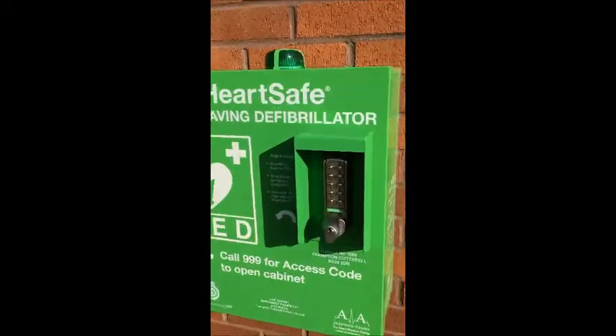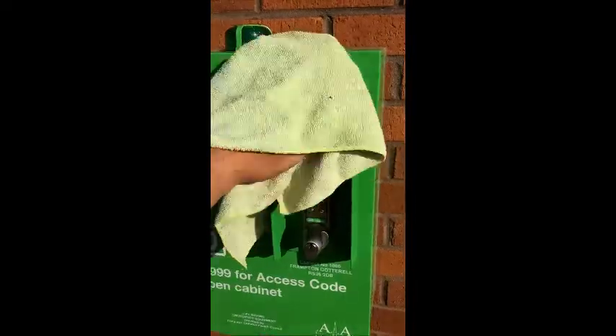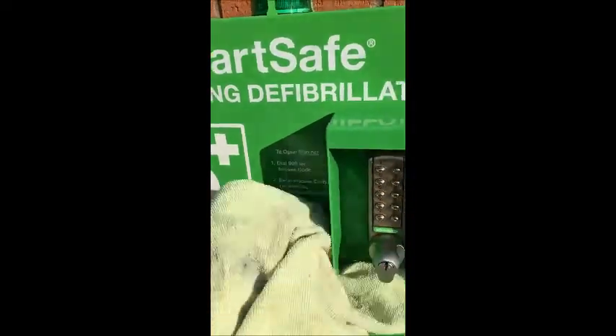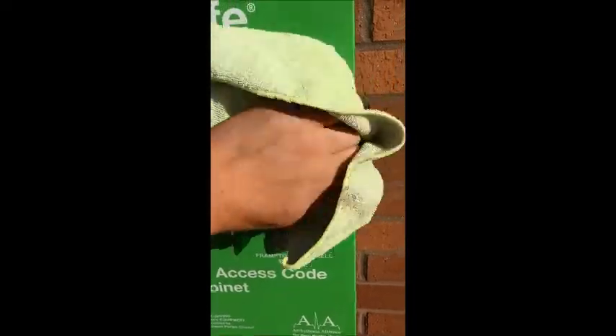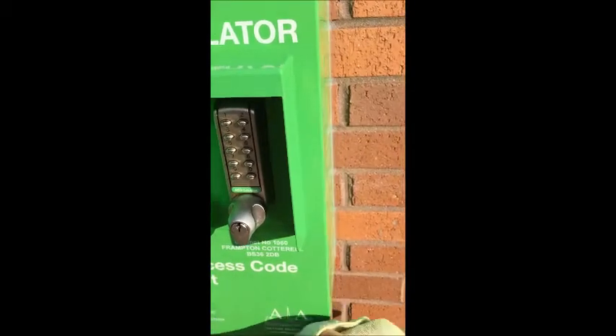As a final step, just to take pride in your life-saving cabinet, give it a general clean all over. We recommend a soft microfiber cloth and some clean water — nothing abrasive, no cleaning chemicals. Just give it a good clean, chase the spiders out, and keep it looking nice and new.